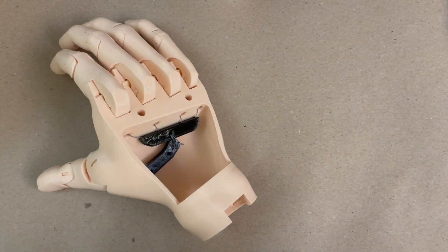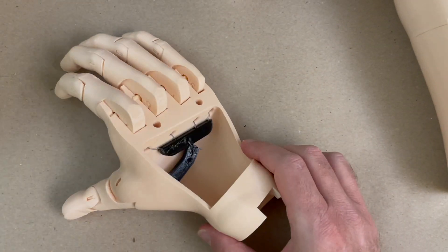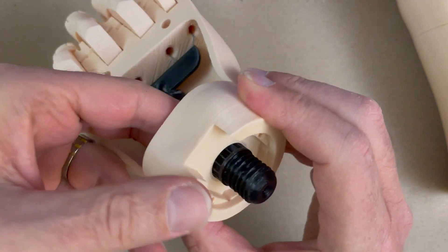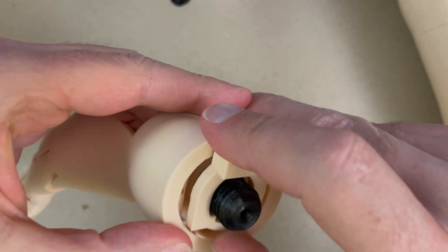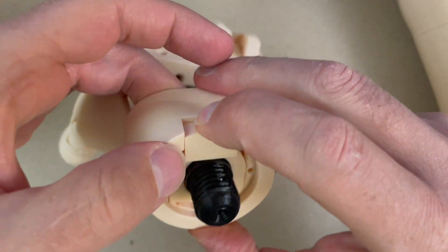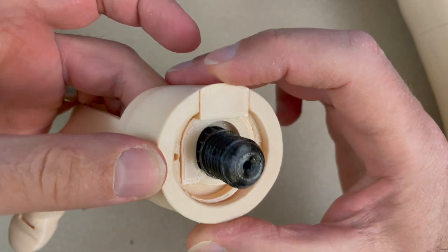Here's my hand that I have already assembled and strung together. The first thing we're going to do is put the wrist bolts in here. You should have in previous videos already tried this to make sure everything fits and sanded it down to be nice and smooth, because this is the last time we're going to put it together. I have the button in and then the cover on top.